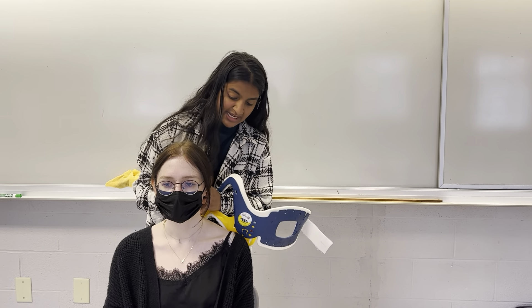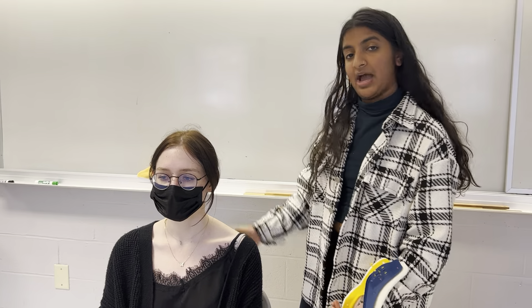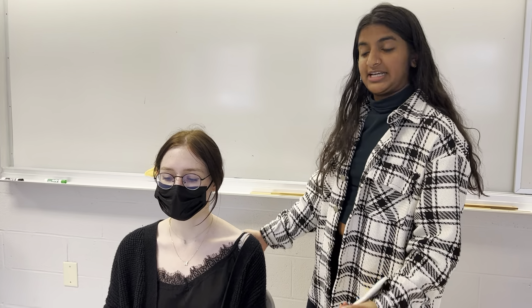The first thing you want to do is make sure that your patient is in a neutral, in-line position. You can do this by having a partner help maintain that in-line position, making sure their spine is all in-line together.